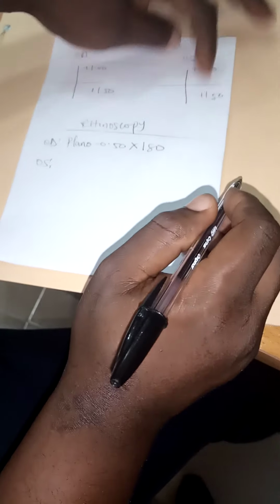This is 180. The same thing applies to this: plano as well. So I will subtract my working distance. Plano minus 0.50, axis 180. Now, subjective. What are my subjective findings?